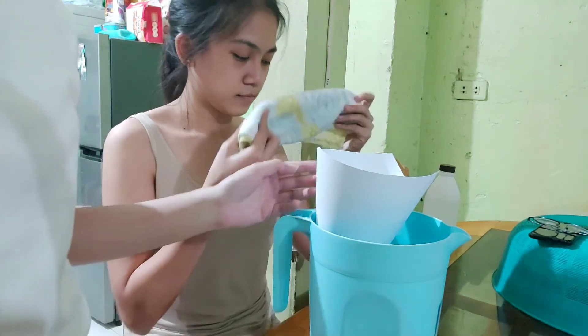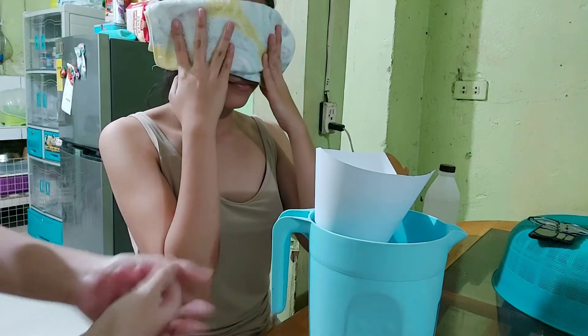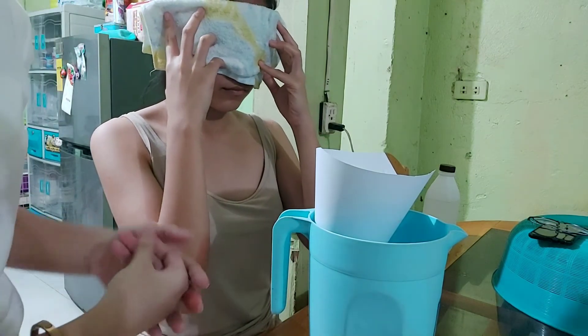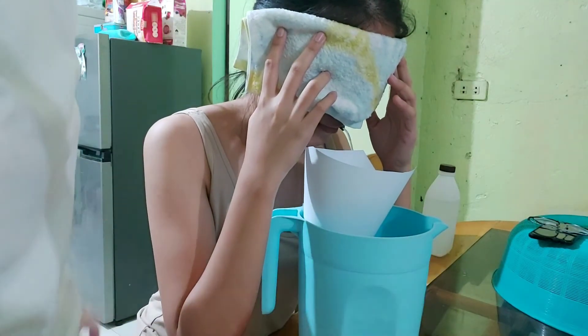I now have a funnel placed over the pitcher's mouth. I will now instruct the patient to inhale the steam for 15 minutes with caution or as prescribed. So ma'am, I would want you to inhale the steam for about 15 minutes.